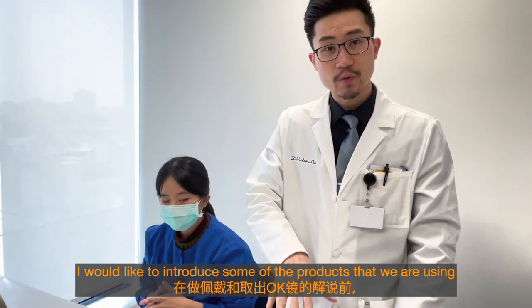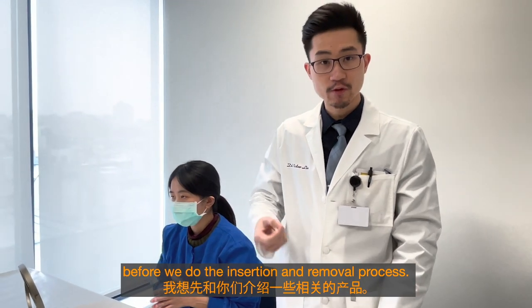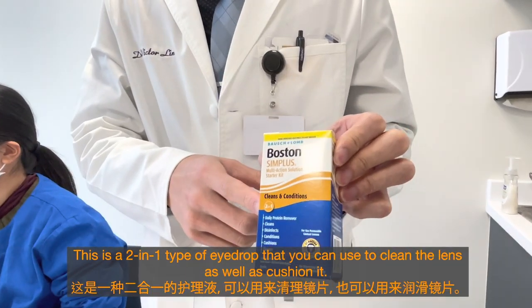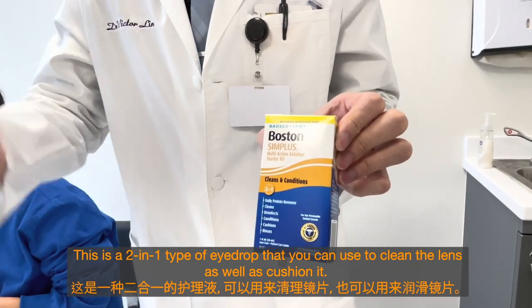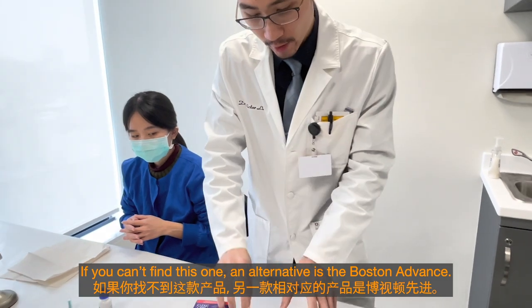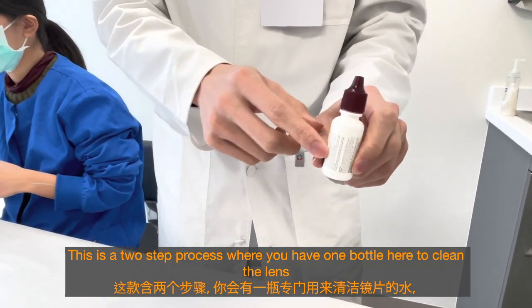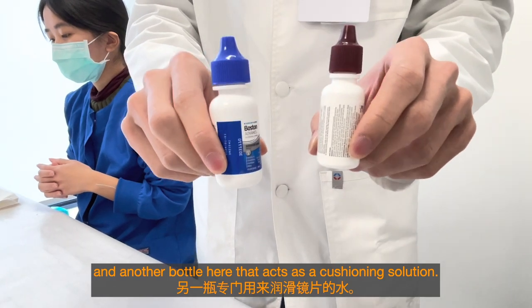I'd like to introduce some of the products we are using before the insertion and removal process. The product we usually recommend first is the Boston Sim Plus. This is a two-in-one type of solution that you can use to clean the lens as well as cushion it. If you can't find this one, an alternative is the Boston Advance, which is a two-step process — one bottle to clean the lens and the other as a cushioning solution.